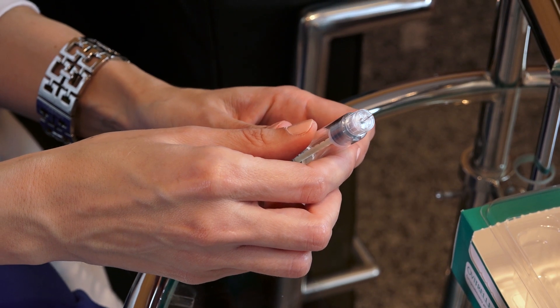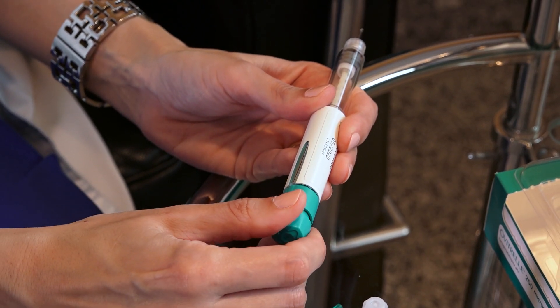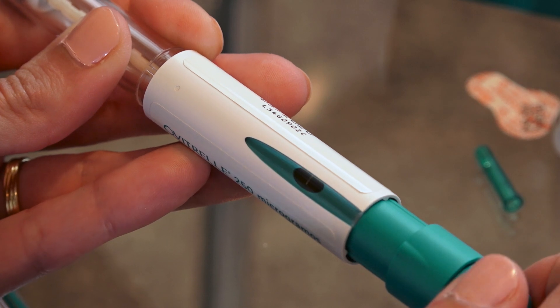Next, select the correct dose. In our case, when Ovitreal is administered before ovarian puncture, we need to inject the total amount of medicine that is in the device. In order to do so, twist the top part of the device until you see a dose of 250 on the screen.